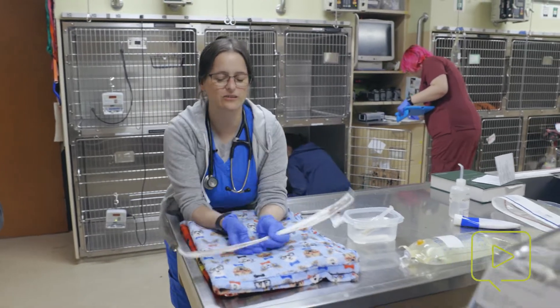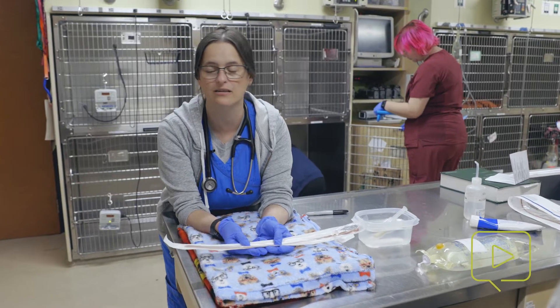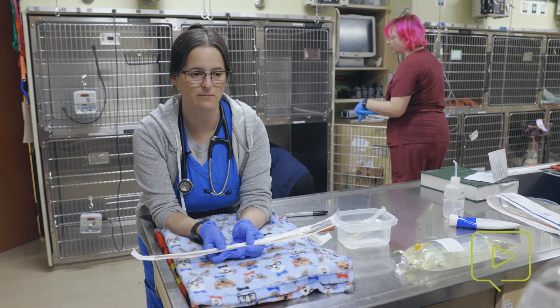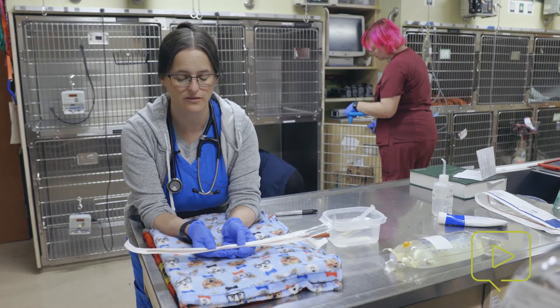You want to use the largest bore tube that you can for the size of your patient, because you're going to be less likely to introduce this into the airway — into the trachea — with a large bore tube. But you also don't want it to be too big for the esophagus. So you kind of have to eyeball it based upon the size of your patient and what you would expect for the size of their esophagus.